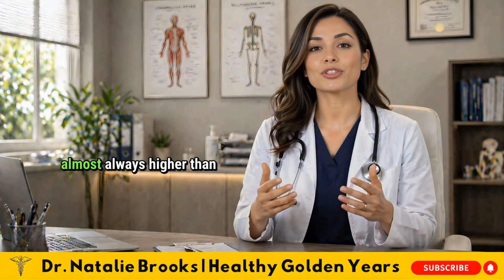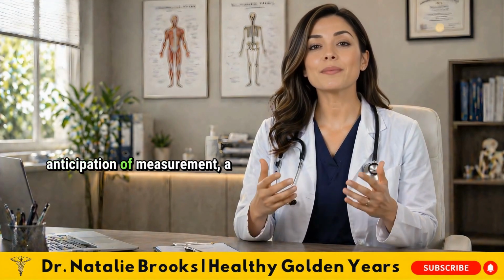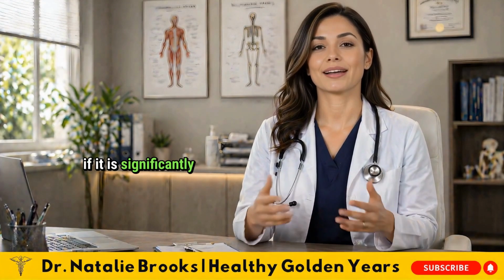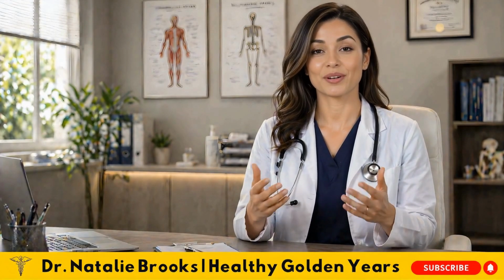Your first reading is almost always higher than subsequent ones because of the mild anxiety or anticipation of measurement, a phenomenon called the first reading elevation effect. Discard the first reading if it is significantly higher, then take the second and third, and use the average of the last 2 as your actual number.